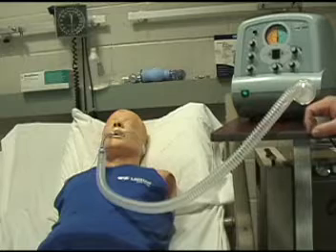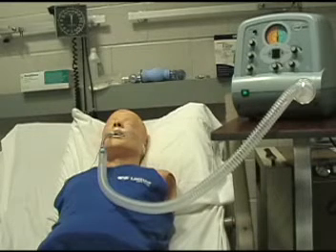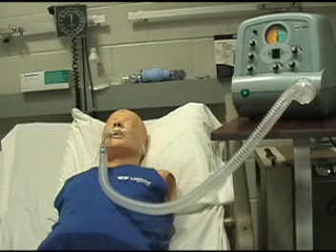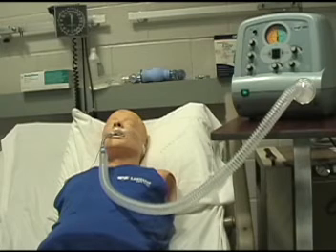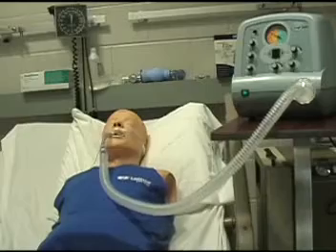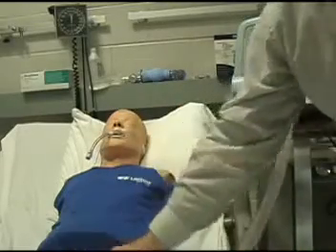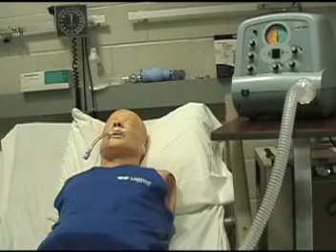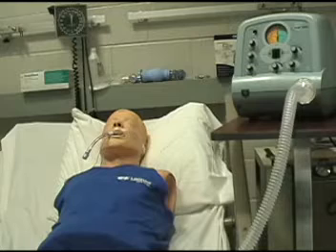I'm going to attach it and we have one cycle — positive, negative. Two cycles. Three cycles. Four cycles. And five cycles — I'm going to stop it at that. Notice I stopped it at the pause period; that's also a good place to begin it. You're going to be doing about five cycles of five times, so this is going to take approximately a ten minute period, especially if you get a lot of secretions.